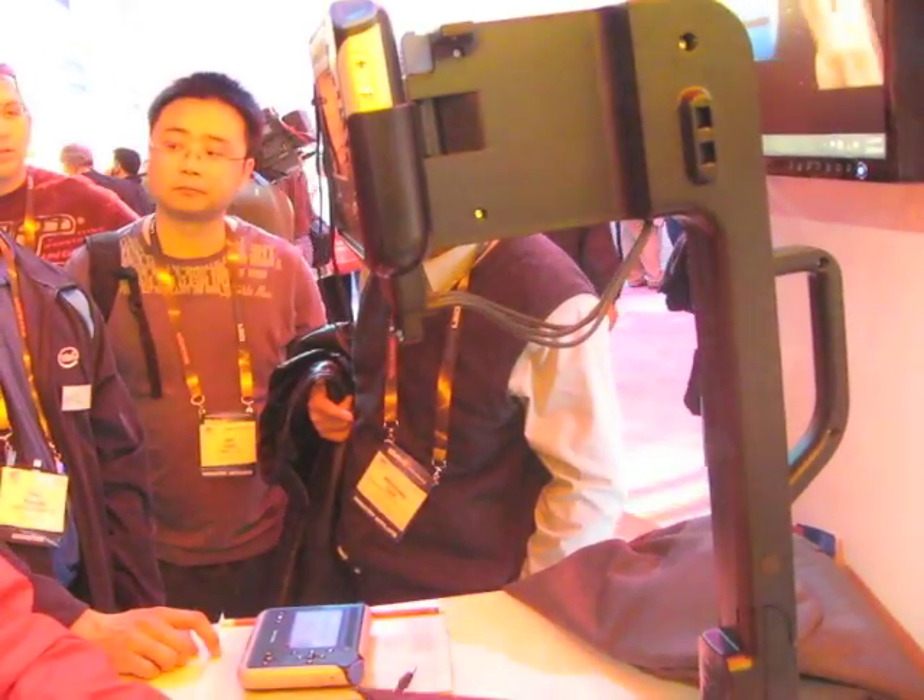My name is Ben Foss and I'm Director of Access Technology for the Digital Health Group at Intel. I filed the first patent on this product three years ago because I'm a user — I'm dyslexic, I don't read well. And this is a way for me to gain independence.